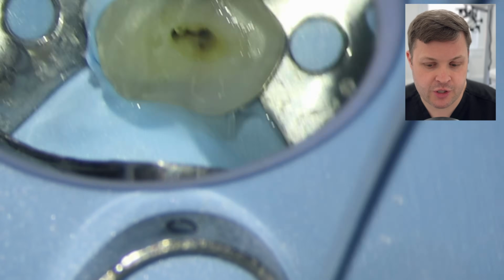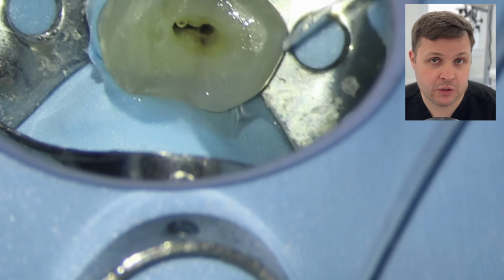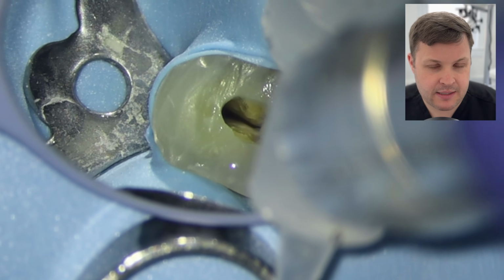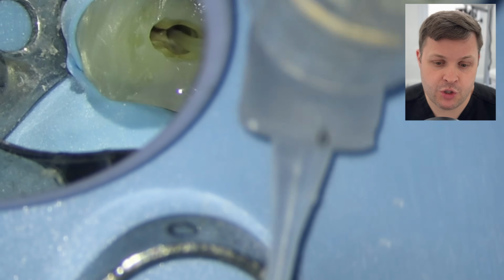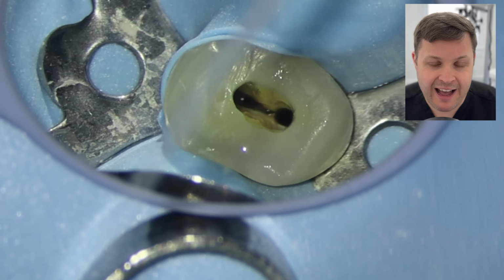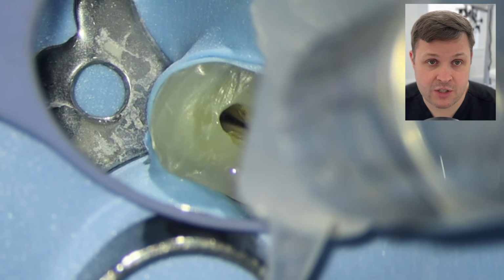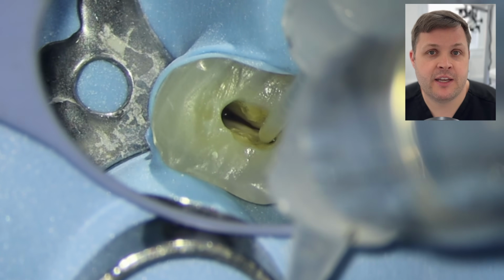And again, it doesn't. So that's not to say that they don't join, because maybe we're going to shape the buccal and we find out that they do join. But again, it's moving towards that maybe these have got 2 separate canals. And that is significant. If it isn't obvious to you, it's significant, because when you come to obturate this tooth, you need to know if they join or not.